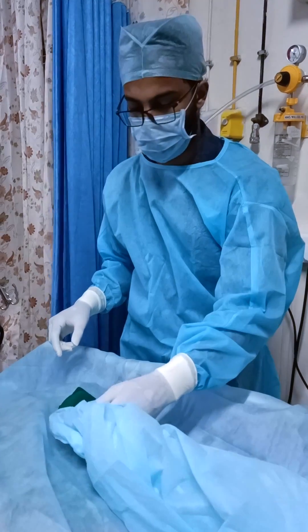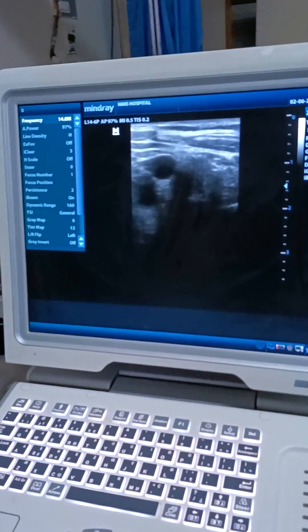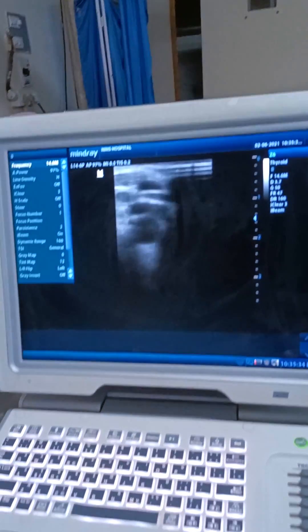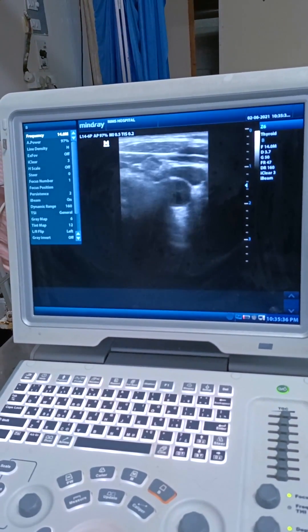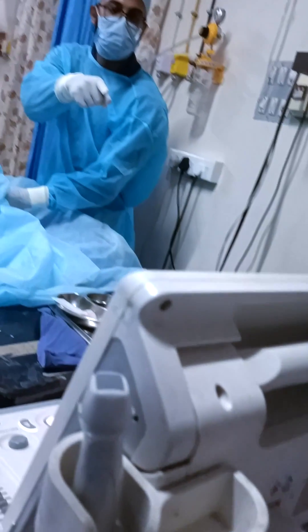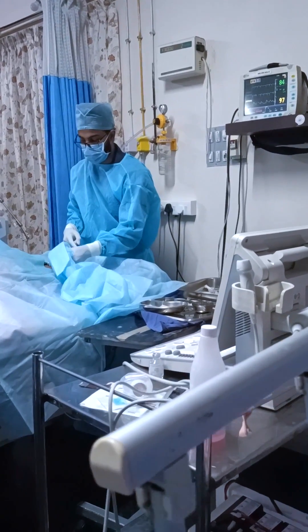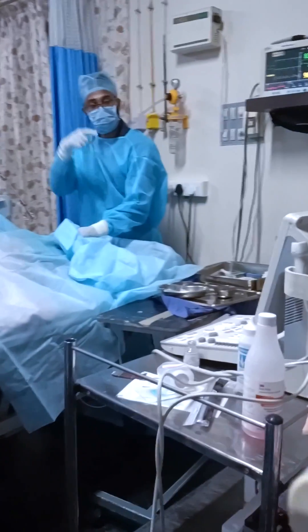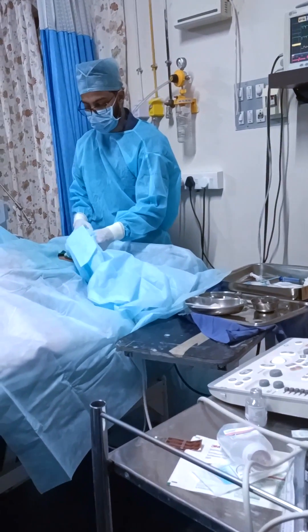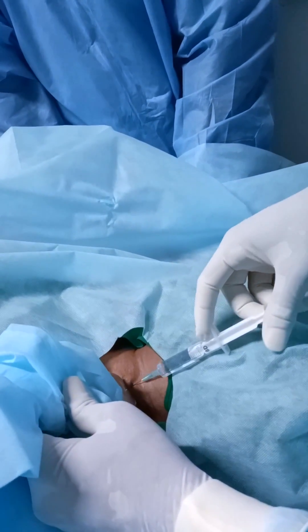I am placing the probe on the neck and I am visualizing the IJV and carotid artery. The one which is compressible is the IJV. The one below is the carotid artery, which is non-compressible. If an ultrasound machine is not available, you may do it with the help of a landmark — the approach most widely used is between the medial and lateral heads of the sternocleidomastoid muscle, one centimeter lateral to the carotid artery in most cases.